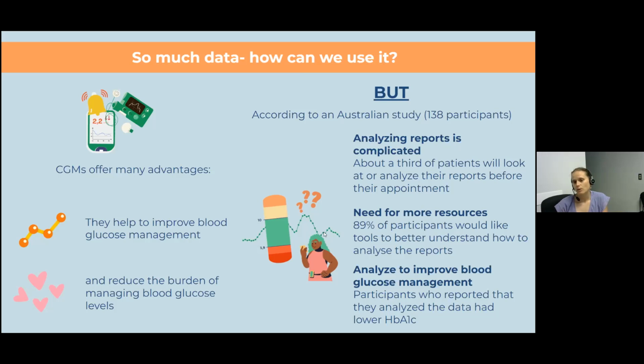And finally, the people who were able to analyze their reports before coming to their appointment usually had lower HbA1cs and better glycemic control. So there is an advantage of analyzing and being able to visualize our reports as patients and not only as clinicians.